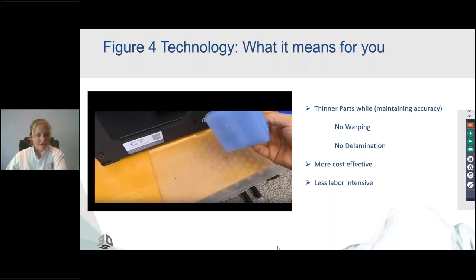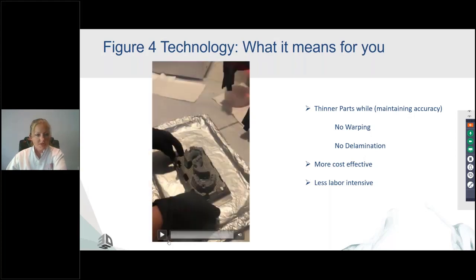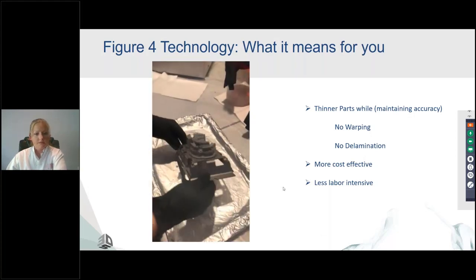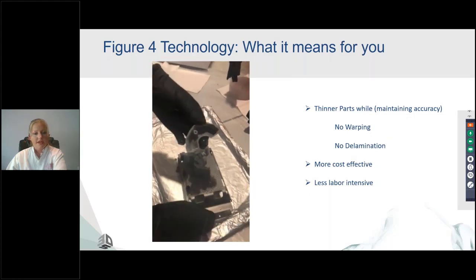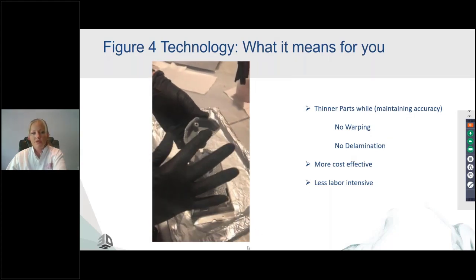Now you don't have to pry ours off. You just twist them off, okay? So here's, sorry about that. You can hear this little snap, right? You just pull them off and you rub the supports.